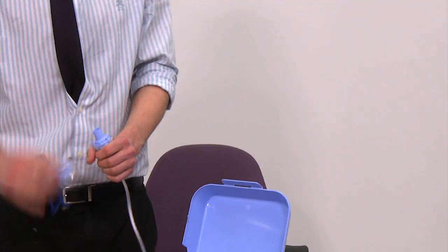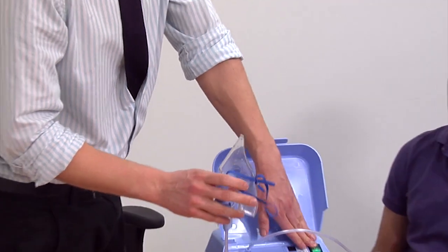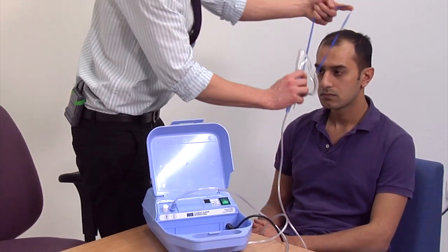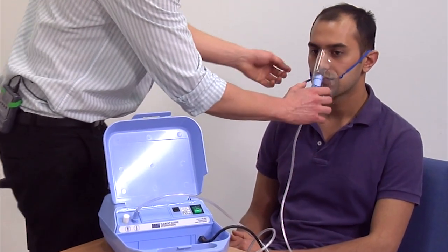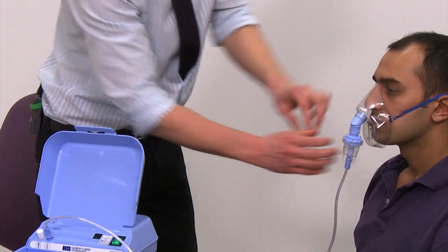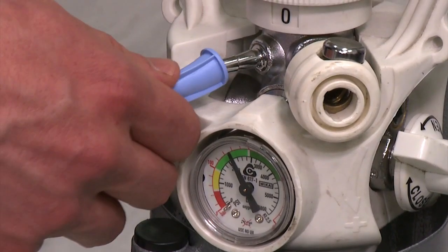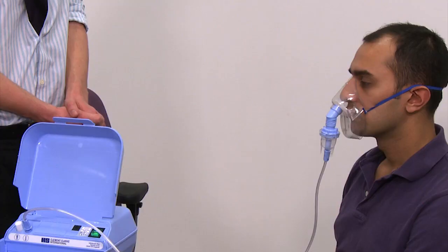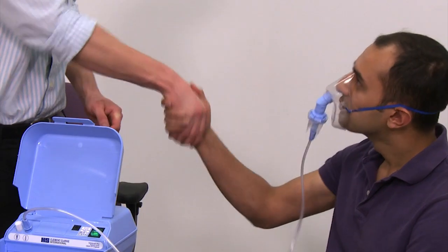Turn on the nebuliser and secure the mask in place. A good fit is essential to ensure that vapour does not irritate the patient's eyes. If the patient requires oxygen therapy, the nebuliser chamber and mask can be directly connected to the oxygen outlet for simultaneous delivery of oxygen and nebulised medication. The oxygen flow rate should be between 6 and 8 litres a minute.